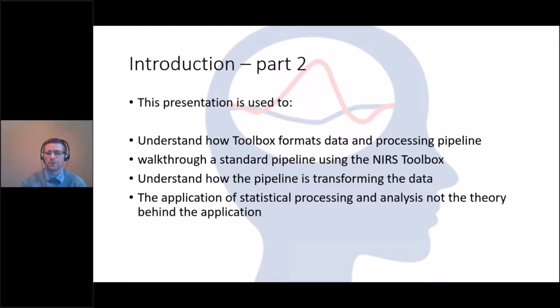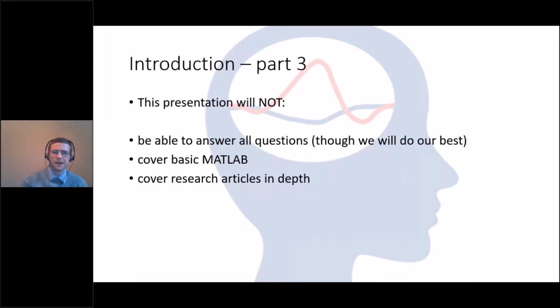And then also, we'll be looking at statistical and processing, a little bit of theory, but this will not be the bulk of it. So if you have questions as to why you would do certain things, if you have questions as to the background of the statistical analyses or the processing, we're not going to cover that today. And then finally, we will answer all questions that we can, but there's going to be a lot that we likely can't answer today.